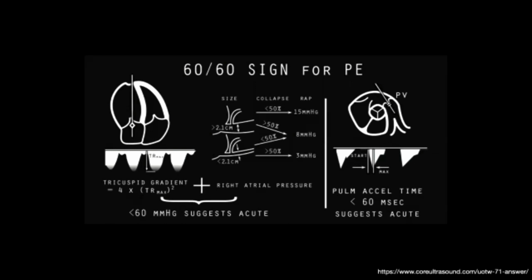This is a very, very helpful sign in clinical practice. And when we see this, we find it to be quite helpful. The other sign that Matt may talk about in subsequent slides may be the notching, and I'm going to leave that up to him, and then we can elaborate further upon why the notching occurs in the pulmonary artery waveform and why the timing of the pulmonary artery notch matters. Hopefully that answers the question.